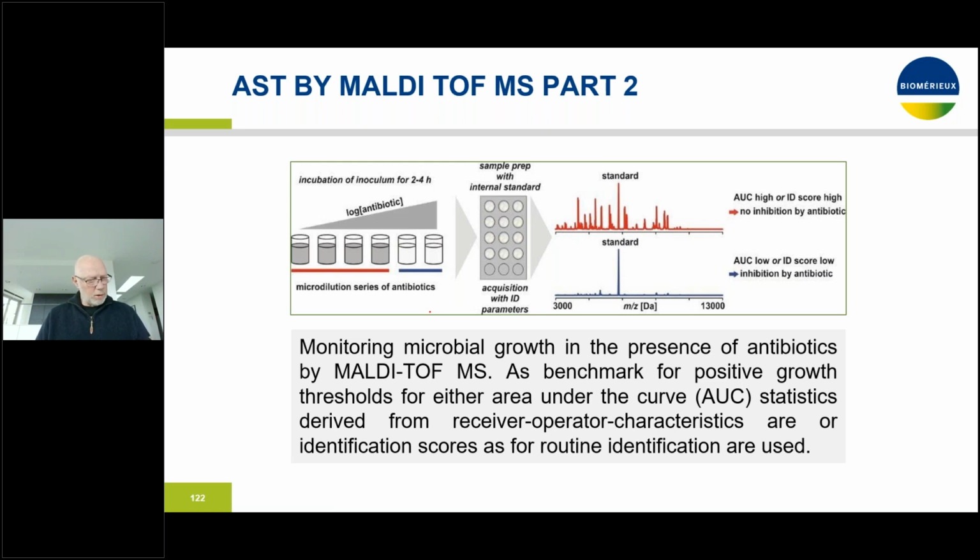Like Marina already said this morning, it is still largely manual and difficult to automate, so that's another problem. And the biggest problem for me is the fact that in the current automated susceptibility testing systems, and there's 4 or 5 on the market, you can look at 1 bug in combination with immediately 20, 30, 40 antimicrobials in different dilutions, and you get the result altogether.